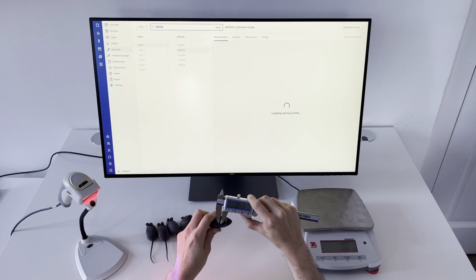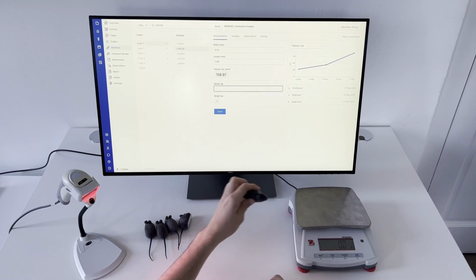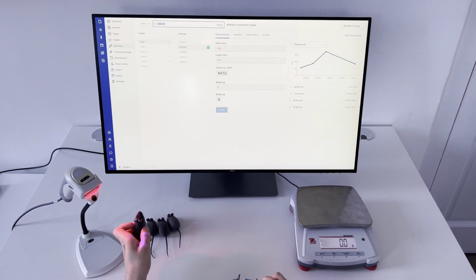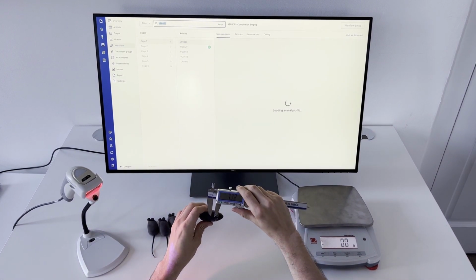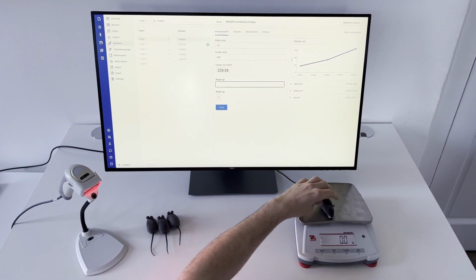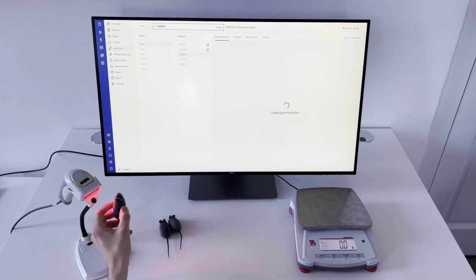So here in our video, what you'll see is that a scientist is scanning a mouse using an RFID chip, which allows for its identification directly in the platform, is then utilizing Bluetooth calipers in order to measure the dimensions of that tumor, and then is weighing the animal. And as you can see, all of this information is immediately being captured in the platform itself, allowing for precise hands-free capture of this information. And this not only streamlines your work, but reduces time inefficiencies by up to 33%.